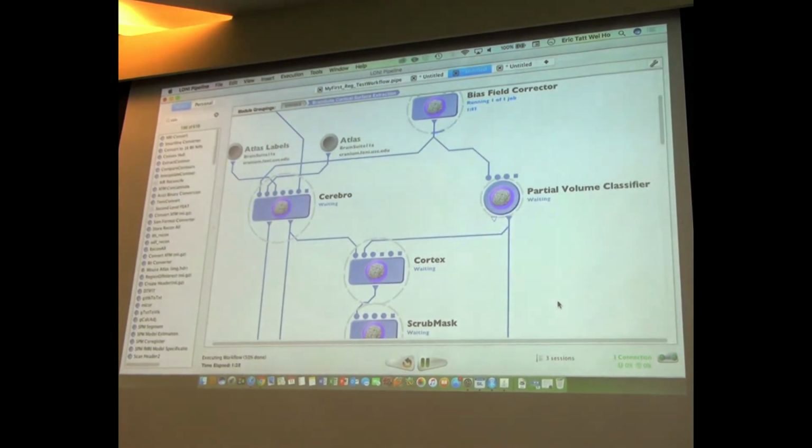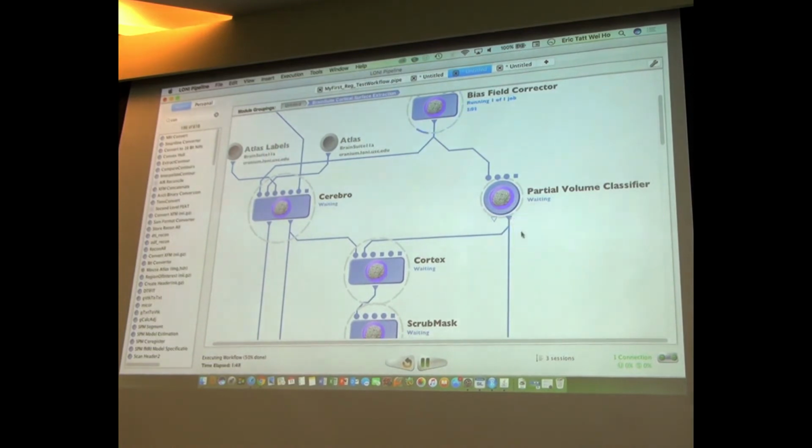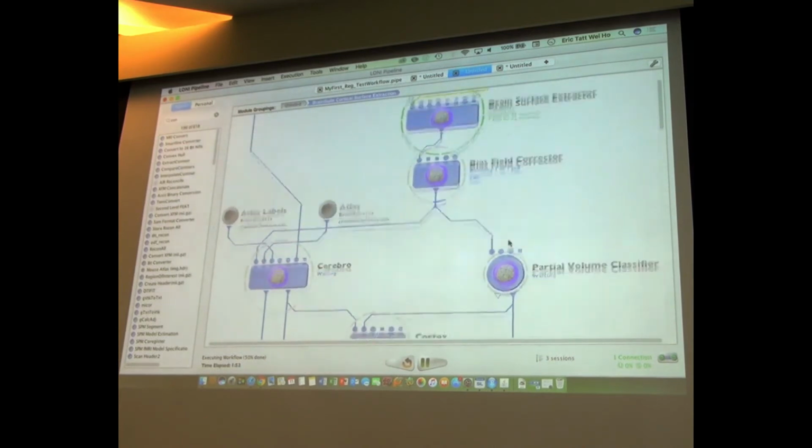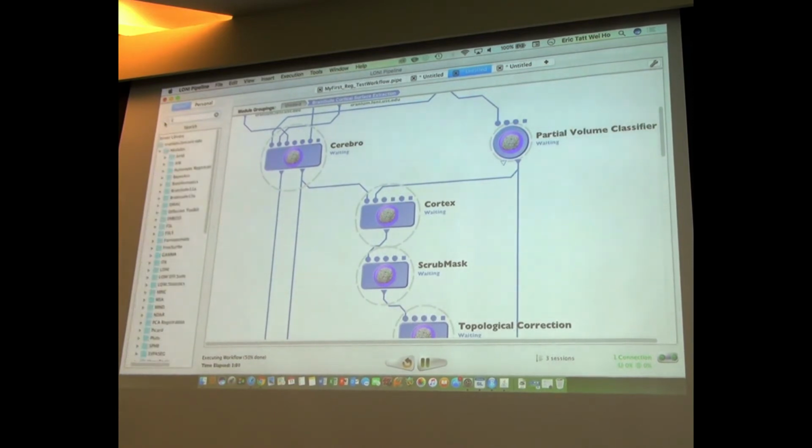You may want to save these as well, because oftentimes the amount of gray matter is an indicator. In Alzheimer's disease, it shrinks. So after this partial volume classification is done, there'll be an IMG volume that you may want to save out. I'm not saving it here because that's not the process. It's not saved by default, let's put it this way. So that's one example. The converters, again, you can search the library to find various converters.